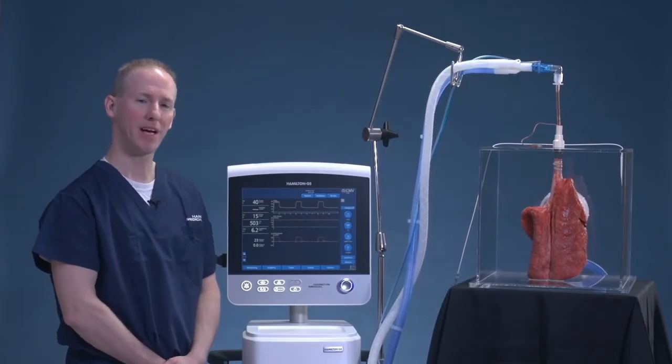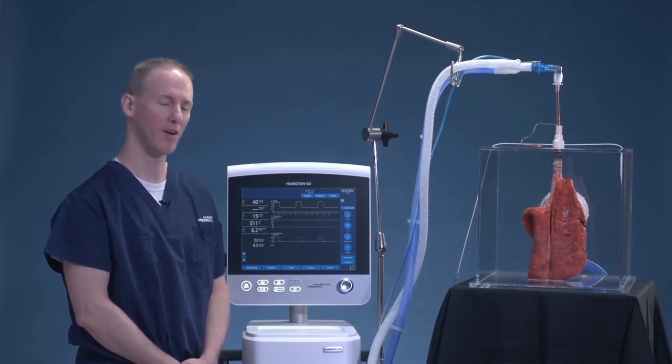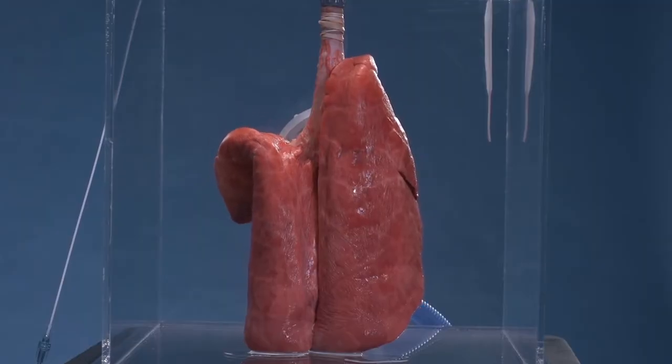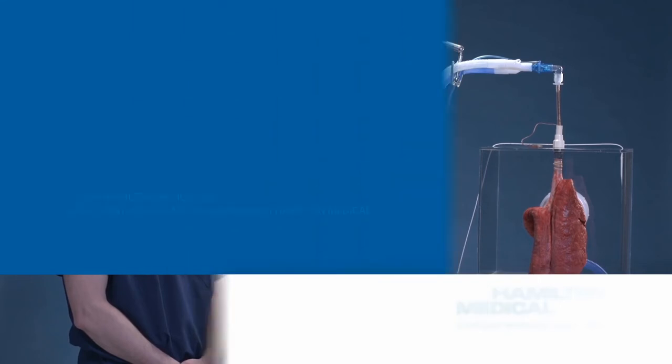So by equally matching the pressure outside the lungs with PEEP, we are effectively recruiting alveolar units that were previously collapsed. This in turn enhances our oxygenation as well as our ventilation and works towards a truly lung protective strategy.